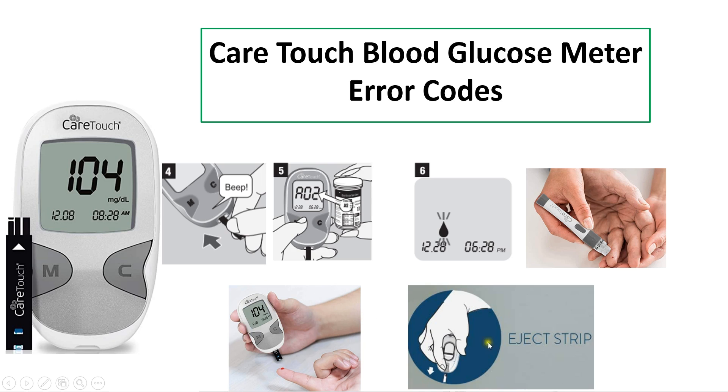After the 5-second countdown, the meter displays the blood glucose value. The meter also has a strip eject feature — there is a button on the back side. If you press that, the strip will auto-eject; there is no need to manually pull the test strip.